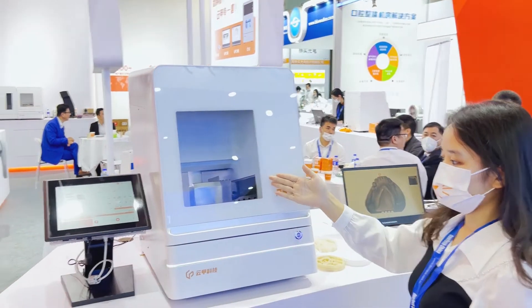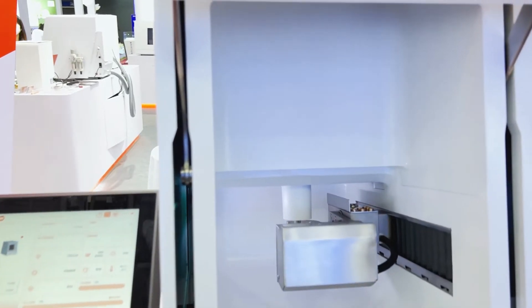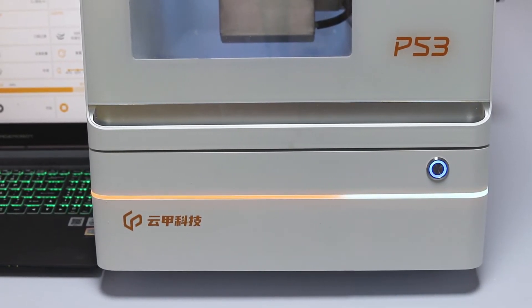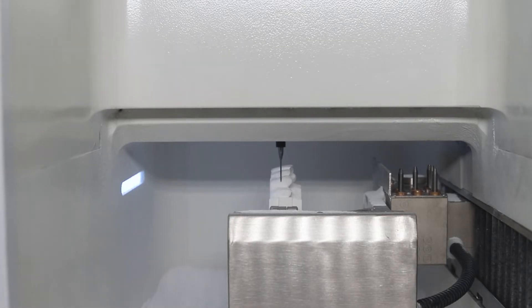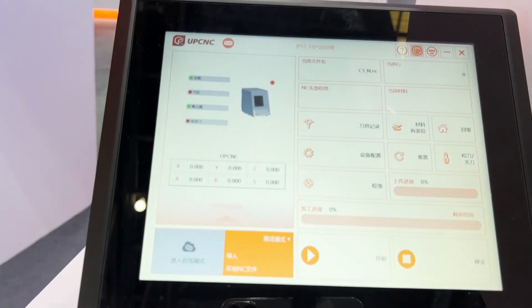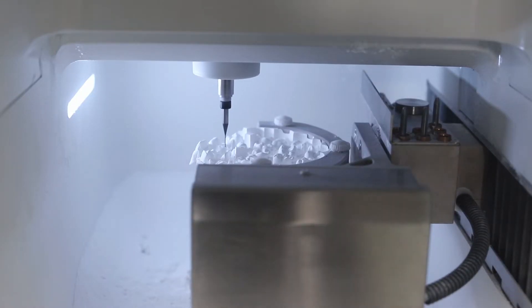Here you can see the P53 dental milling machine, upgraded from P52. The main difference is that P53 has faster milling performance and improved milling strategy for better quality results. Features include Wi-Fi, LAN connection, milling status LED indicator, 90 degree from T's milling, improved dust collection, upgraded CNC software and so on. Is it fantastic? Let's see how it moves.